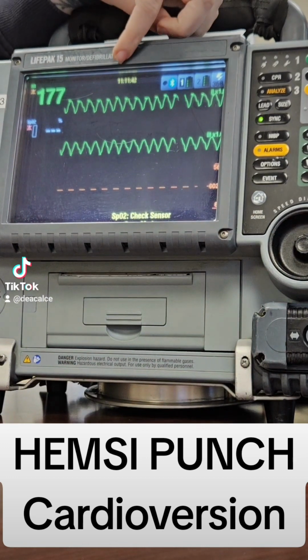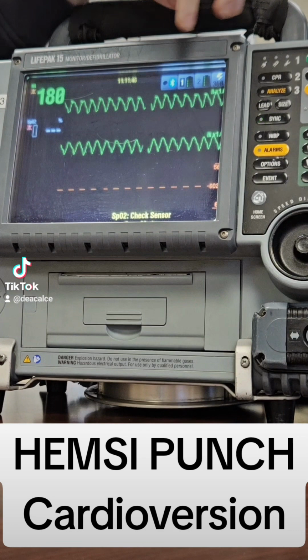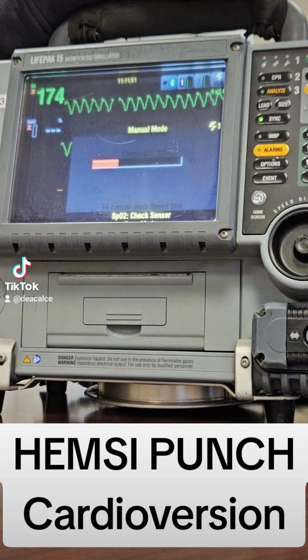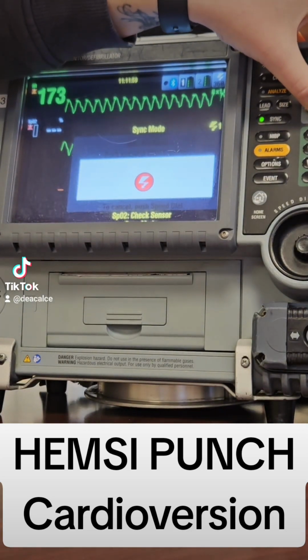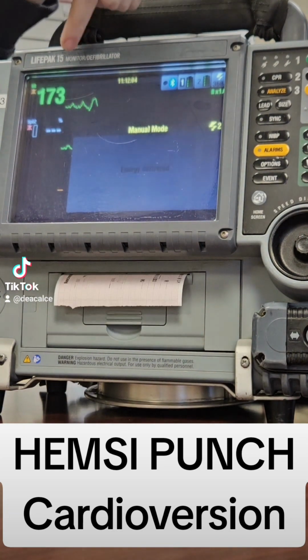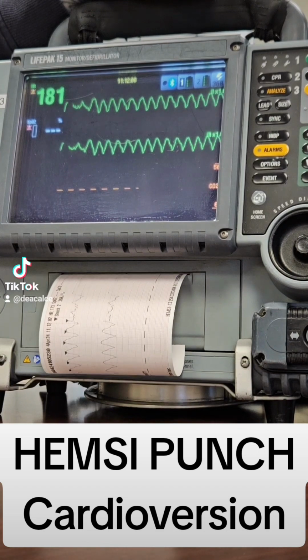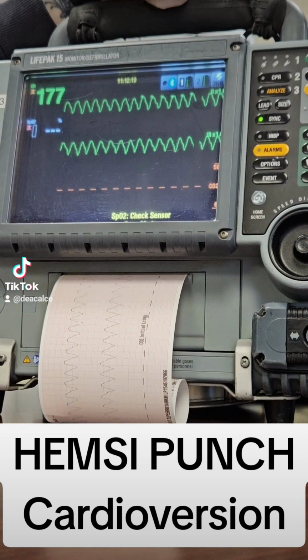Once you hit that, you also need to verify that you still have the synchronized indicator at every QRS. You can then hit the charge button. Clear your patient and hit your energy button. There you go. After that, you'll notice that the synchronization has dumped. After every synchronized cardioversion, you will need to resync with the patient's QRS.